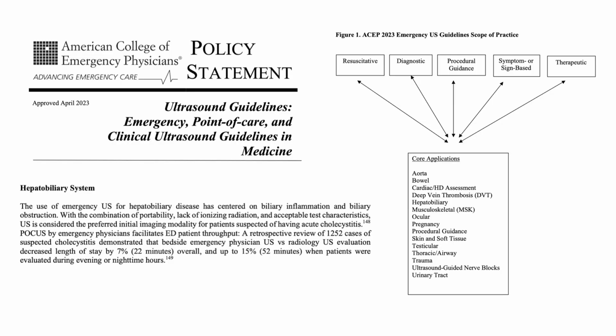To give you a little bit of support or credibility to this, hepatobiliary ultrasound is one of the core modalities that ACEP, the American College of Emergency Physicians, recognizes as an acceptable use of bedside ultrasound, right? This document is the main document that ACEP supports in terms of how you do bedside ultrasound, how you set up the program, how you run it, and then the core modalities.